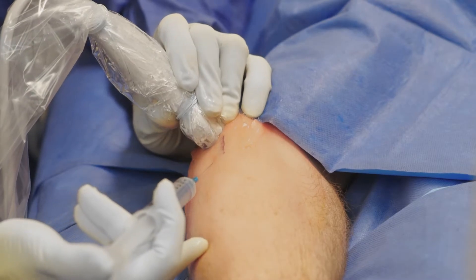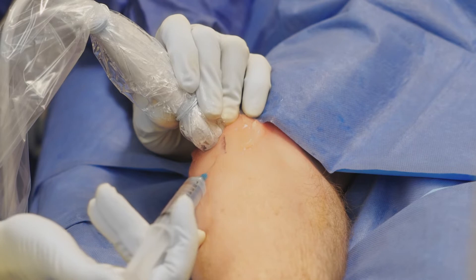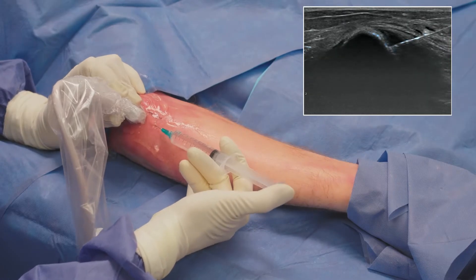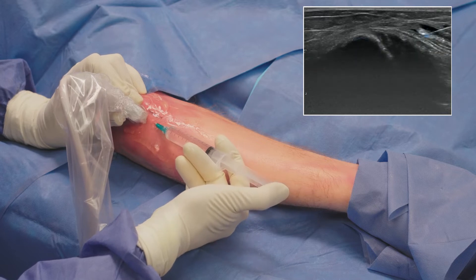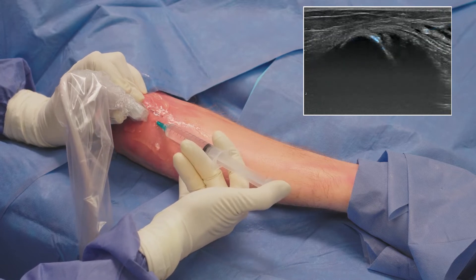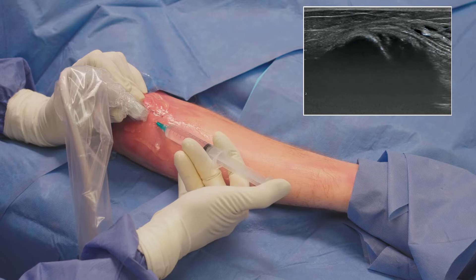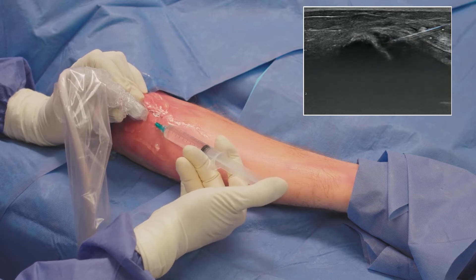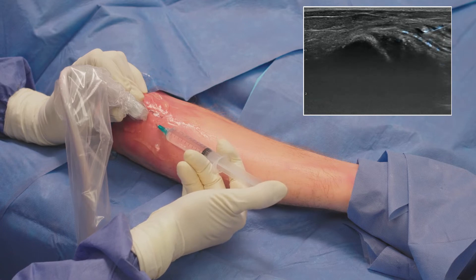To ensure that the patient has minimal discomfort during the procedure, I administer a local anesthetic. As I guide the needle with ultrasound, I anesthetize the flexor tendon mass and then the needle track through the subcutaneous tissue. I make sure to administer the anesthetic both medially and laterally to make sure the area is covered.